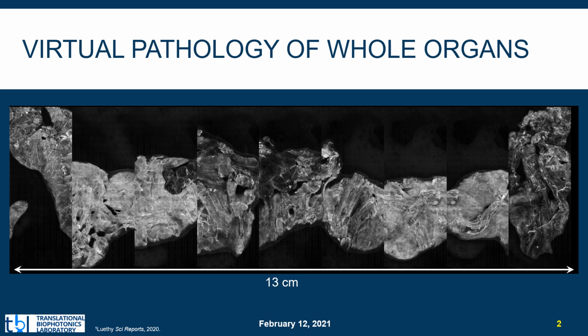acceptable for pathology diagnosis. We believe that structured illumination microscopy is the best candidate for breaking the space bandwidth product challenge in rapid intraoperative pathology imaging because it's capable of performing both optical sectioning and super-resolution, acquiring a larger field of view with the resolution needed for diagnosis in less time.